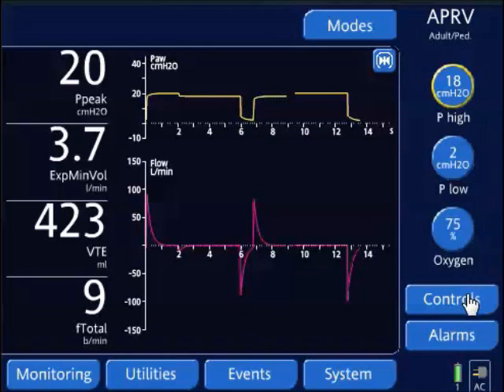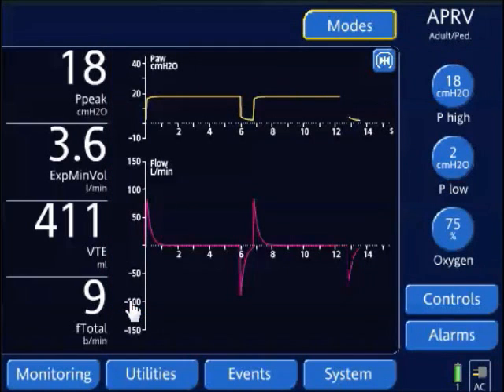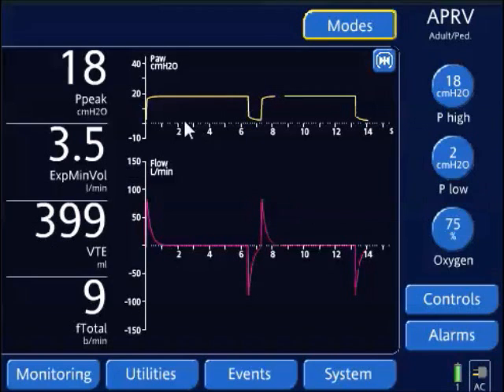I'm going to look at my T high, which controls my P high, and increase this by 0.5 seconds. What this does is slowly lengthen out the P high phase.